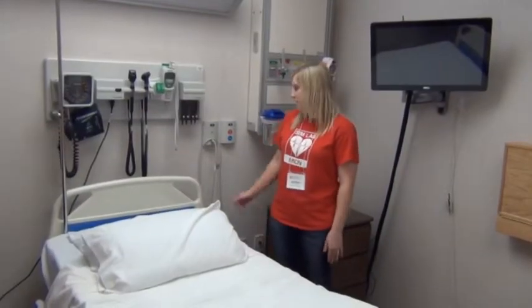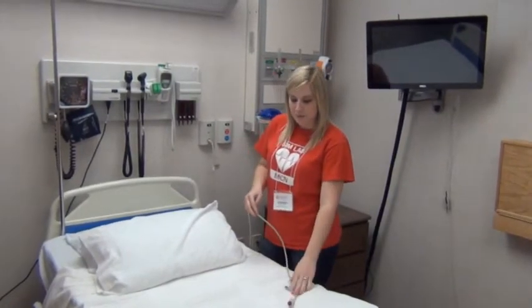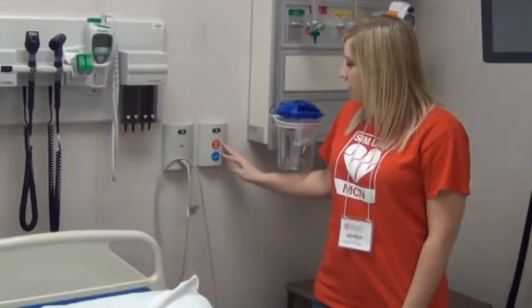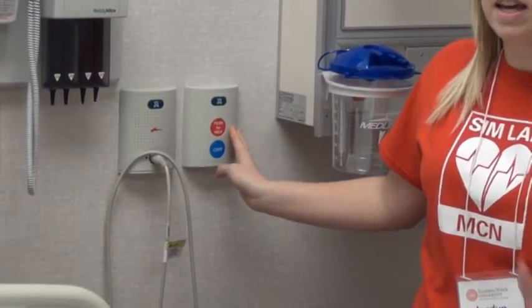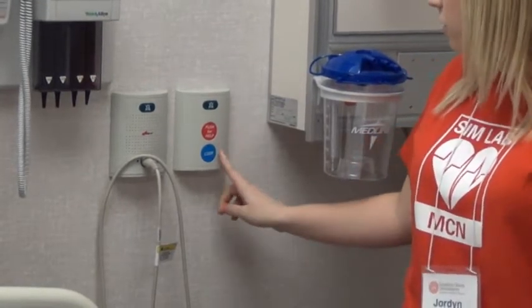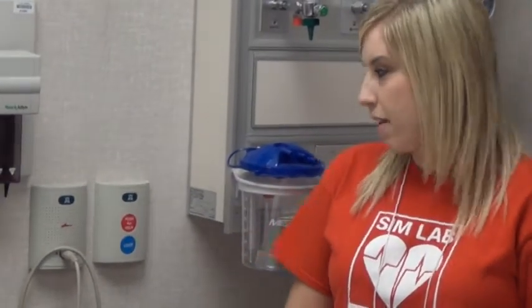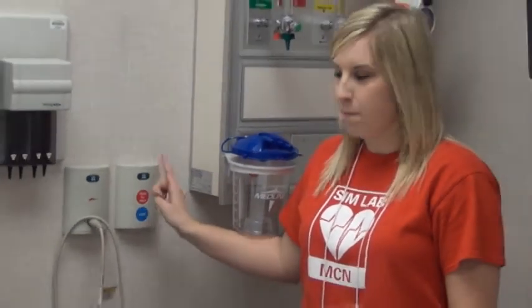Okay, so another part of safety is always making sure our patients have their call light. So you'll want to make sure this is in bed with them so they can get a hold of you if they need you. Here we have our two buttons. The red is for a rapid response. So that is for a patient who is deteriorating but they are still breathing. So that's what that will sound like. And you'll push this green button to silence it. We also have our code blue button, which is for a patient who isn't breathing and doesn't have a heart rate. So it's a little faster. And you'll also push the green button to silence that. We would like for you to press the green button after 30 seconds of the alarm going off.